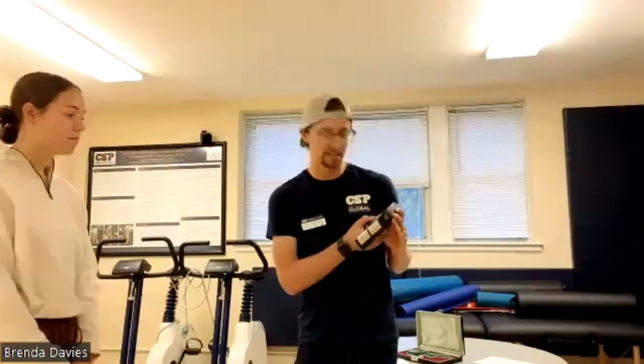We'll start with you as a normal person, I'm assuming athletes, to compare the normal versus the athlete one. You're at 5'6.5", I believe. And then go way down through your age. 20. I'm gonna be 20. Perfect.